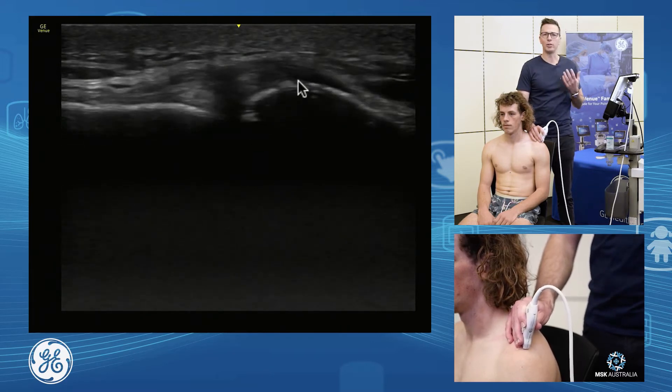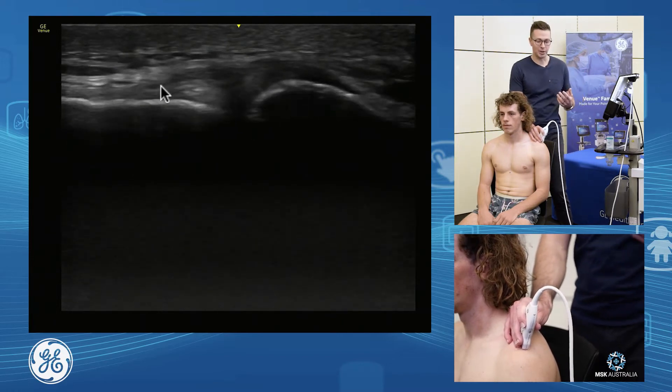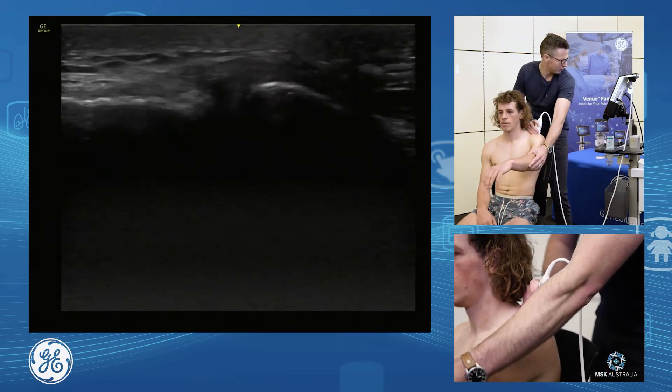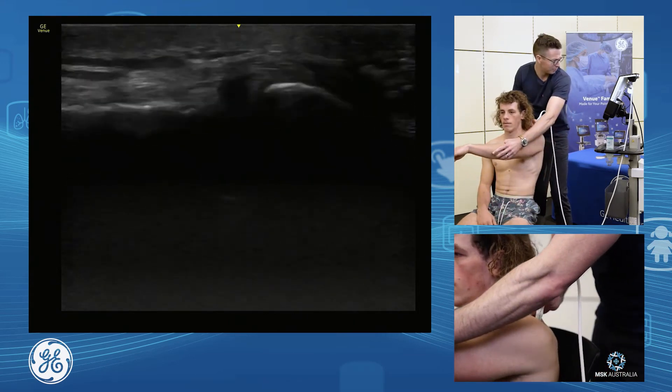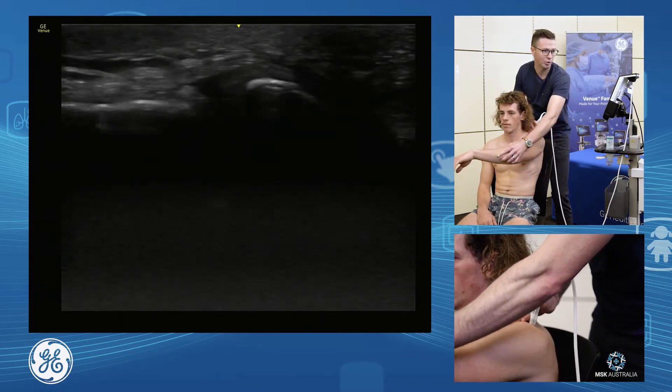We assess the capsule for irregularity, if it's post-trauma or degenerative. To assess the stability of our AC joint, we can take our arm up into forward flexion, horizontal flexion, and horizontal extension — and we have a nice stable AC joint.